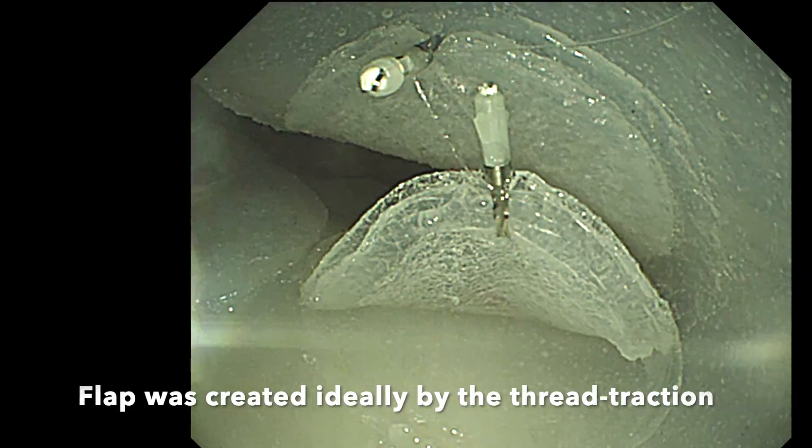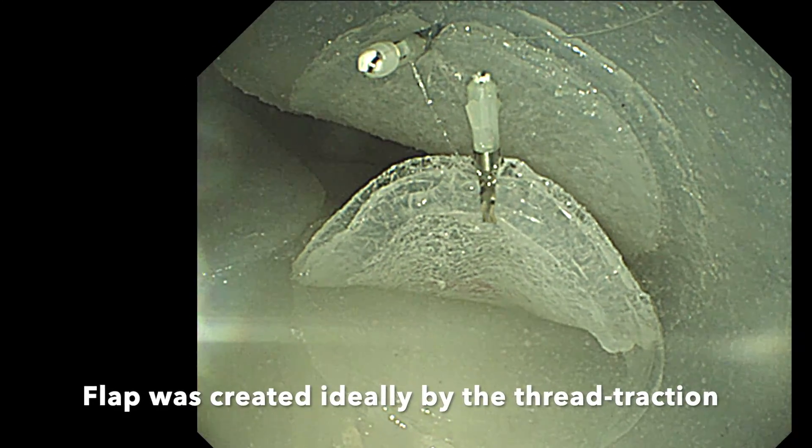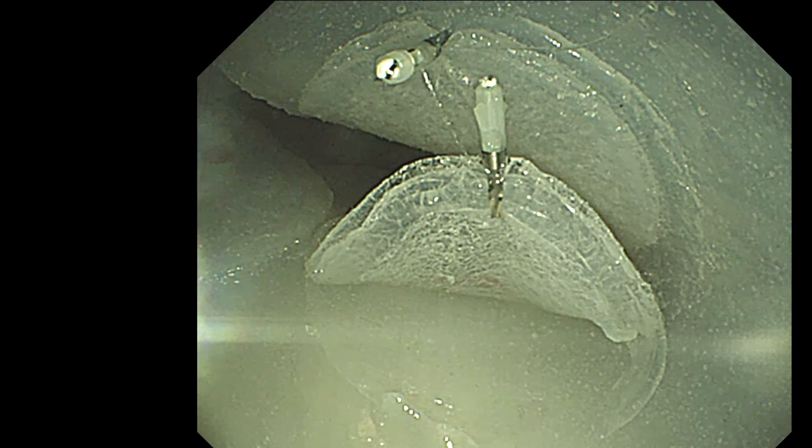Finally, the flap was ideally elevated with traction. A third clip was applied on the flap, and the second clip was used as a pulley.